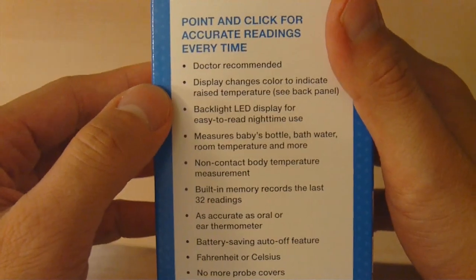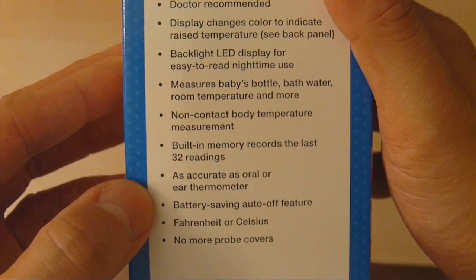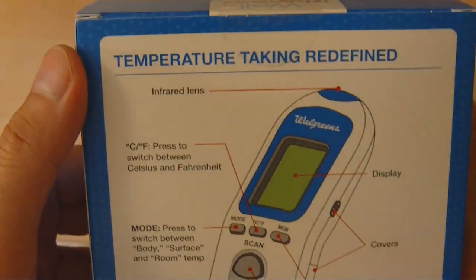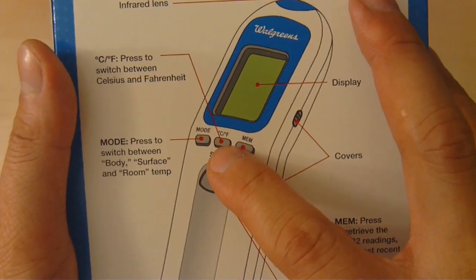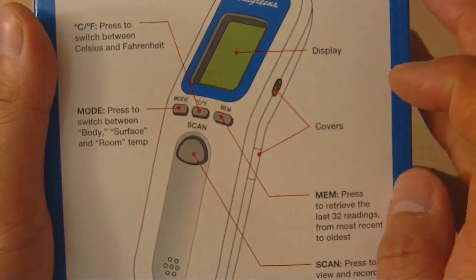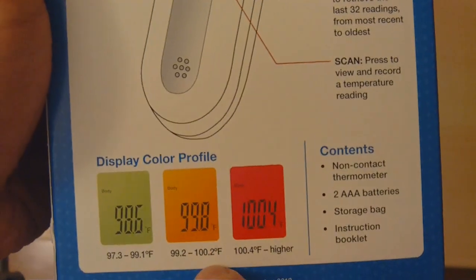It's also doctor recommended and has a backlit LED. Very good in terms of keeping contamination down, because nothing goes into your mouth or ear to be of concern. The back says 'temperature taking redefined.' It has an infrared lens to read, and buttons to control Celsius or Fahrenheit. You hit the mode button to control body, surface, or room temperature. It even has memory for 32 readings and a scan button, plus a color profile to indicate what you need to be concerned about.